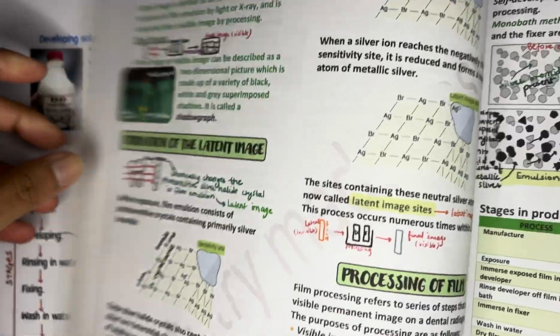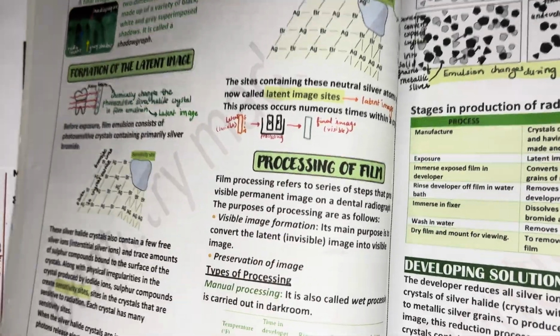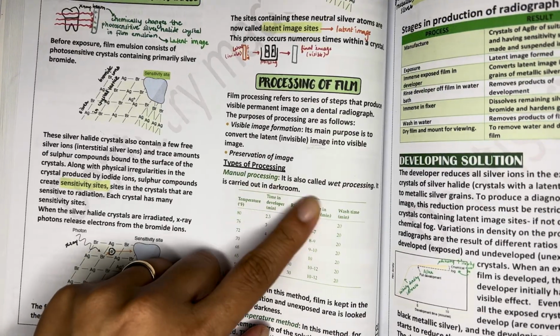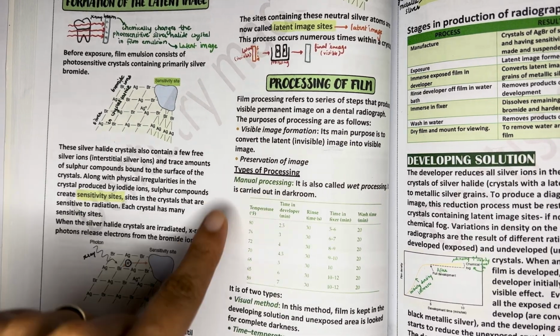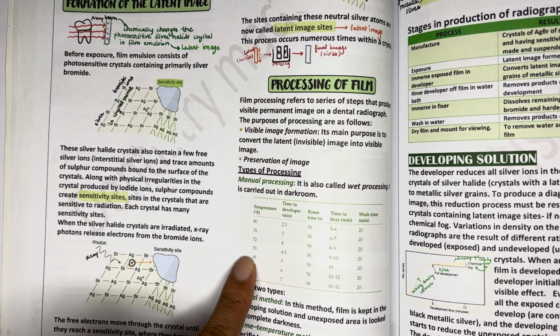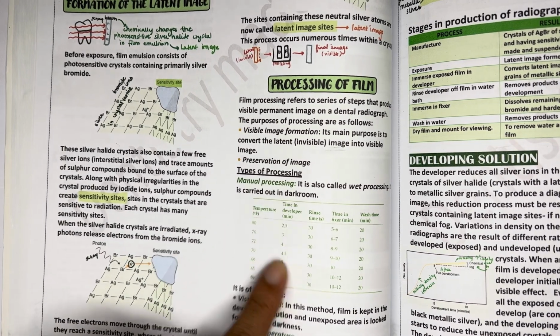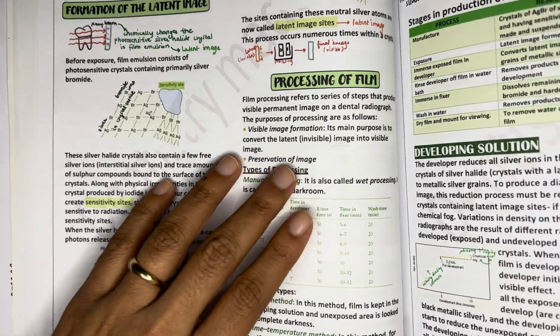The latent image we have already seen, and over here this is the processing of the X-ray. This is the chart that I was talking about for the time temperature method of manual processing. You have different temperatures, and at these different temperatures, this is the time allocated for the developer and the fixer solution that you need to keep the X-ray film in.